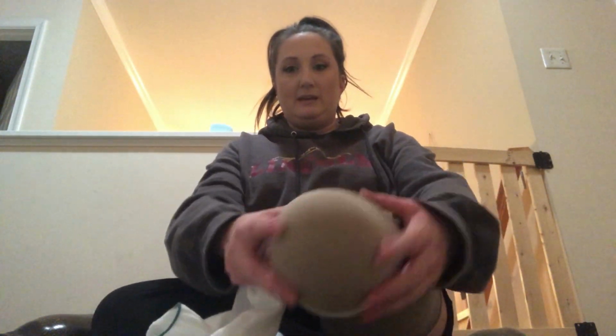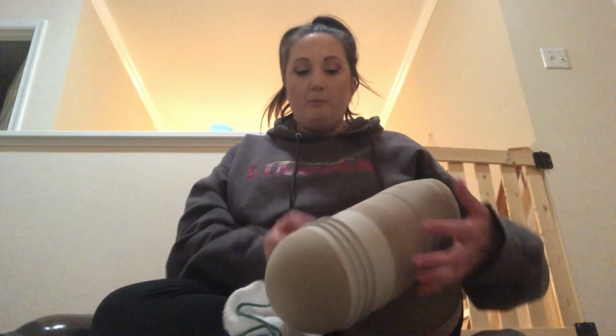Now, then I was thinking, okay, I need this part intact in order to have the suction. But I need the girth of the socks here. And these are the ones that came from my prosthetist office with an open end at both ends. And I was like, that doesn't make any sense. That makes it more annoying. Why is it like that? These are the ones that came home from my surgery that aren't cut out. These are the ones that I've been putting on.